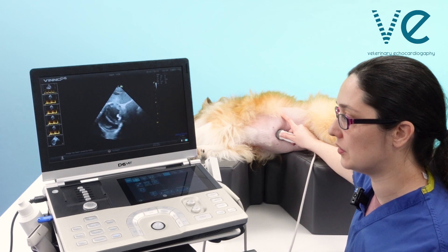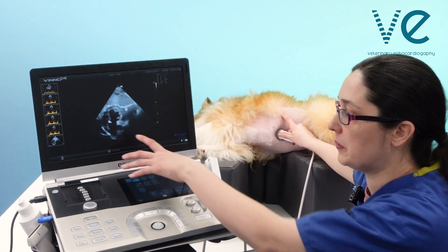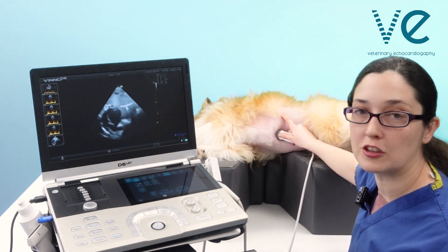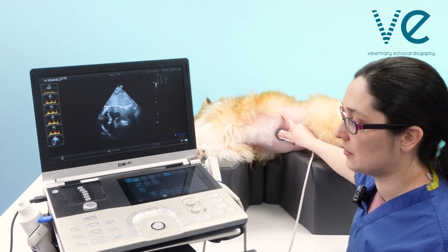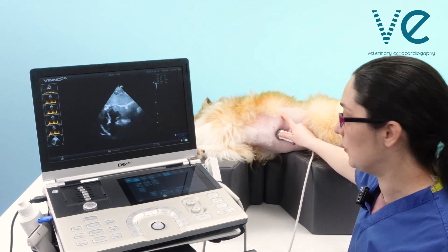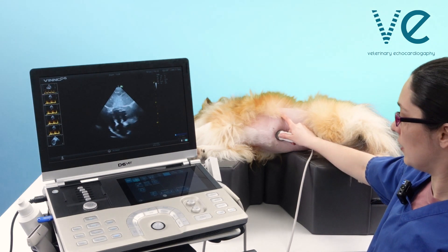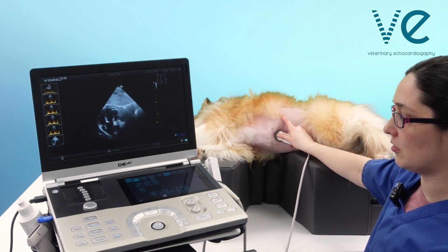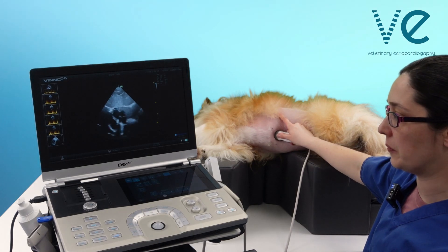What you want is that happy medium where you're just opening up the left ventricular outflow tract and the aorta on your screen. By moving your hand position you can swing that on your screen so that you get it as central as possible.